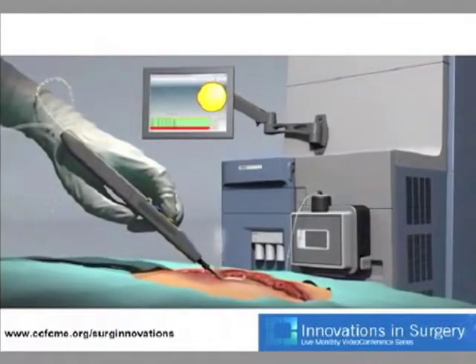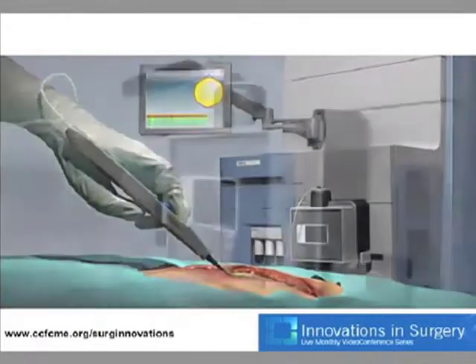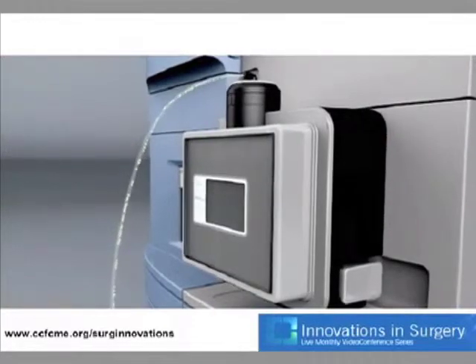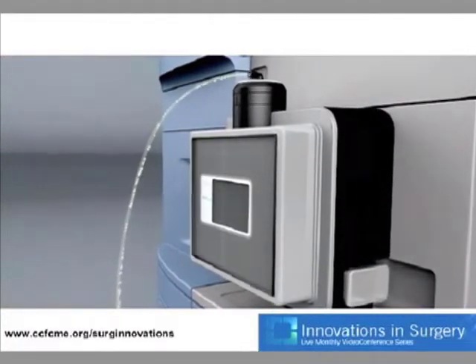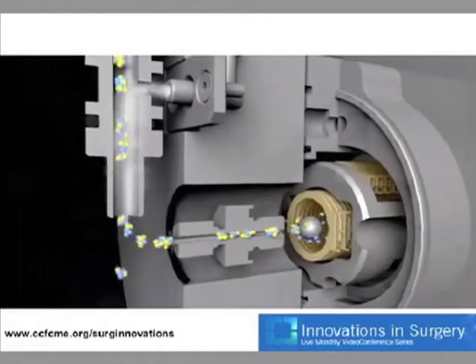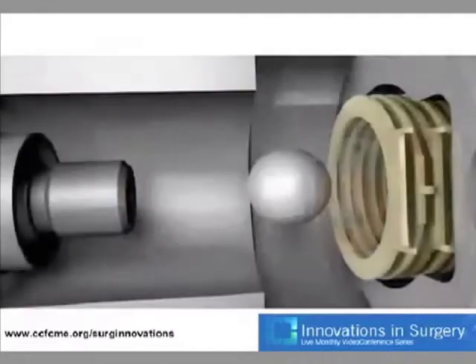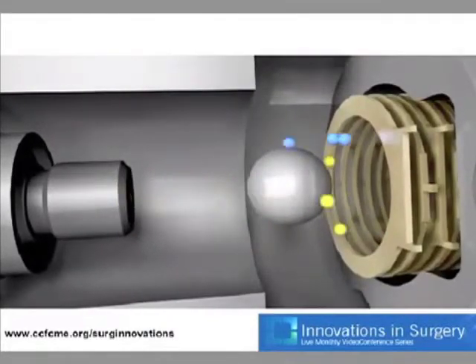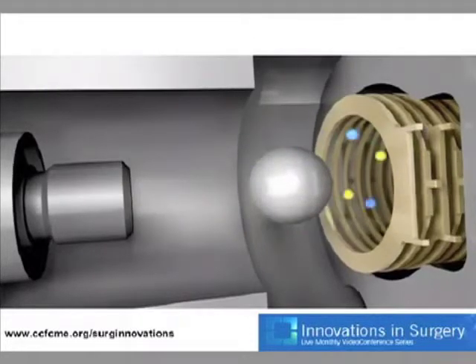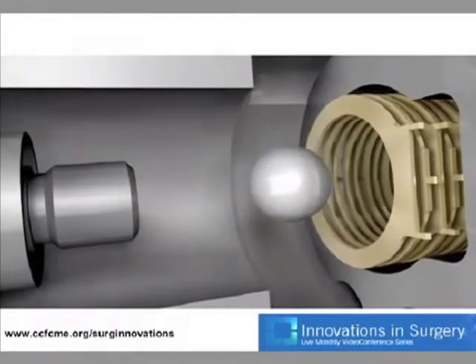At the moment we give feedback with red if it's cancer, green if it's likely to be normal tissue, with an overall accuracy plot. And we also describe the histological subtype of the tissue that we think it is. Just to show you a little bit of the working of the machine, mass spectrometers come in lots of different shapes and sizes. This is a Waters machine. And we use a number of different steps inside the machine to separate out the ions, so that you get very specific information just about the molecules that you're interested in.